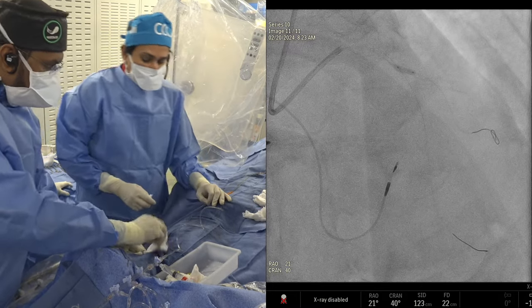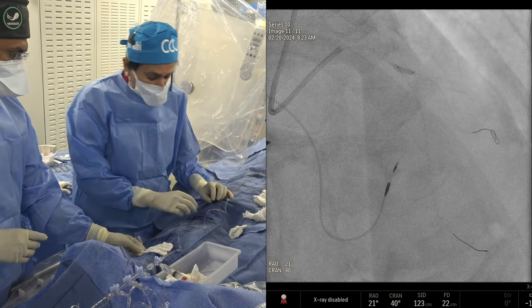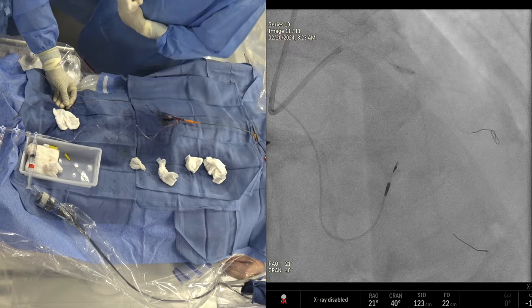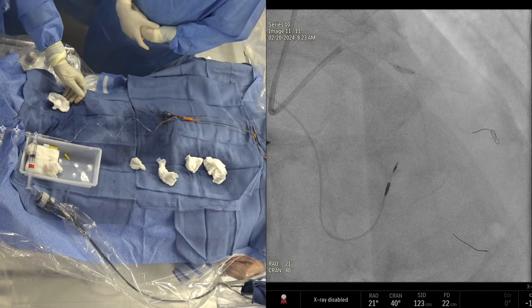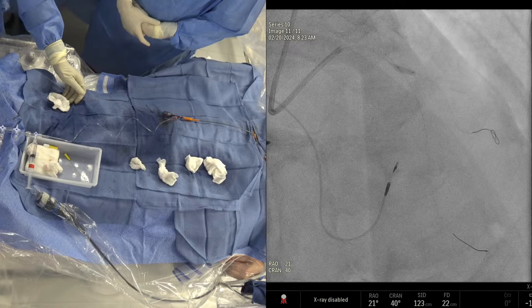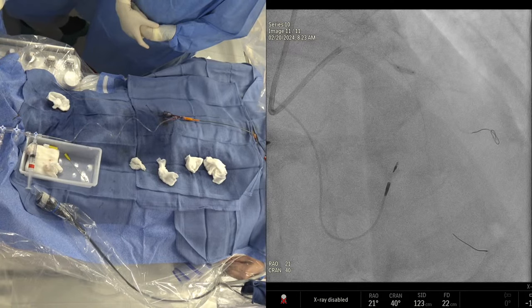You finish your D2. In the meantime, I want to do step crush. But I actually thought about let's try to do a two mini crush with the one main vessel stent. Why not? Let's try. If it does not work out, it does not work out. First prepare the D1 lesion. We do the stent in the D2 and stent in the LAD, but do the D2 stent, take everything out, put a stent in the D1, and then the LAD stent. Okay, repeat it again. Let's try.